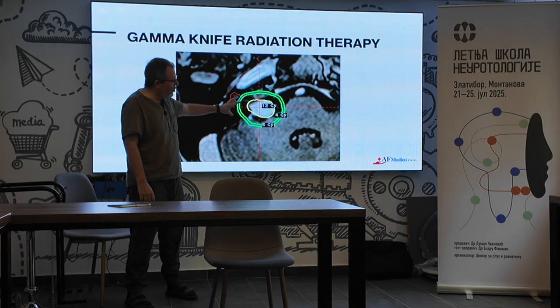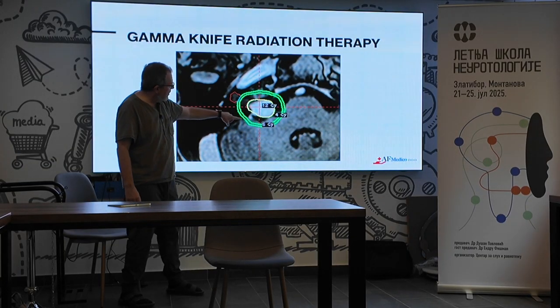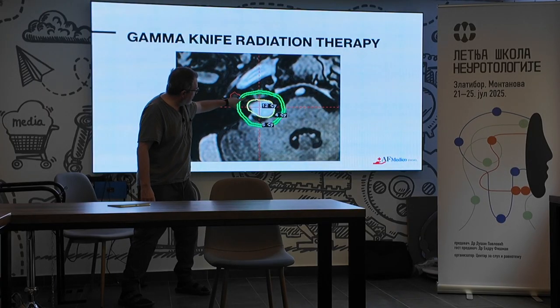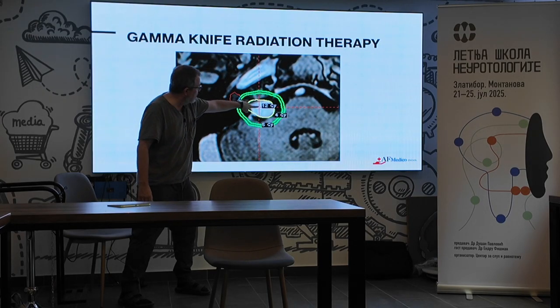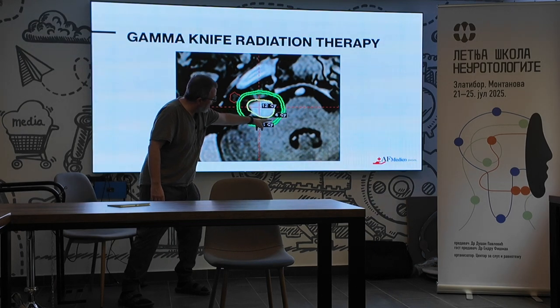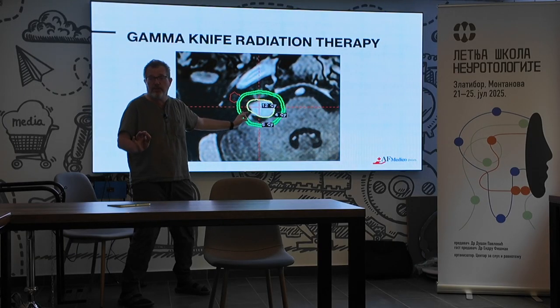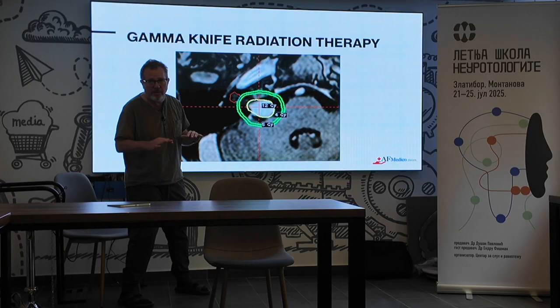Well, look, this is an actual treatment plan. This is a tumor that's about 1 centimeter, and it's away from the cochlea. Here's the internal canal. This is not a common picture. You usually see the tumor located here. So if this is 12 gray, and it's this far out to get to 5 gray and then 4 gray, this is about the optimal situation, and this was a 75-year-old patient without any vestibular problems.